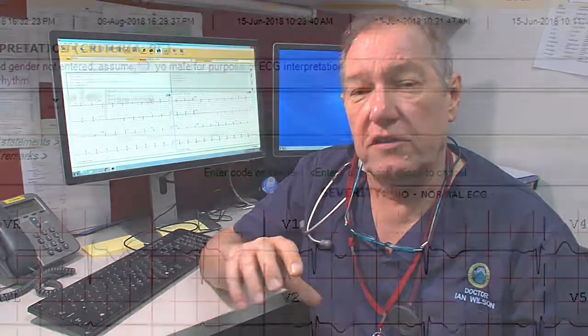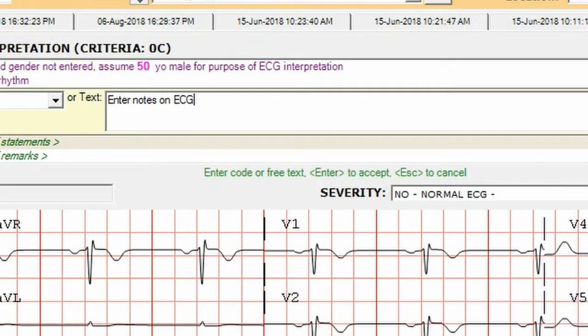Just be aware, when you're working here, we have a service agreement with these little hospitals, and we say we're going to maintain and support them. So doing this process is part of our job here. As a hospital, we indemnify you. We're saying, you're looking after these patients appropriately. I want to reassure you that actually just looking at the ECGs, writing your notes in that little box and confirming it is all you need to do for your documentation for these particular patients.